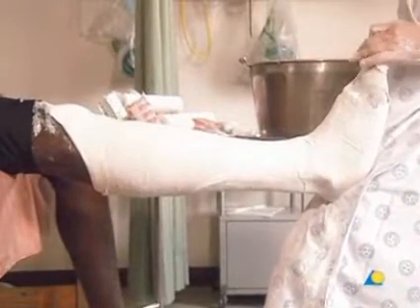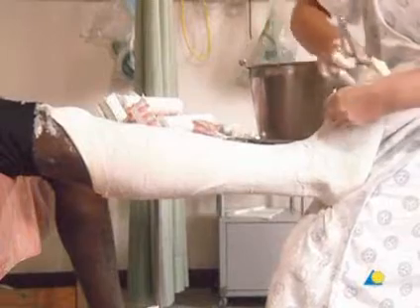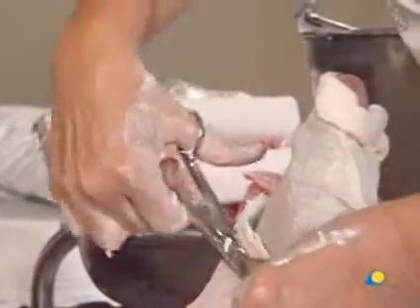The extra plaster covering the toes should be noted, as it ensures there will be adequate support for the metatarsal heads. The excess plaster is now removed with the scissors and the stockinette at the distal end is cut and folded back to reveal the toes.